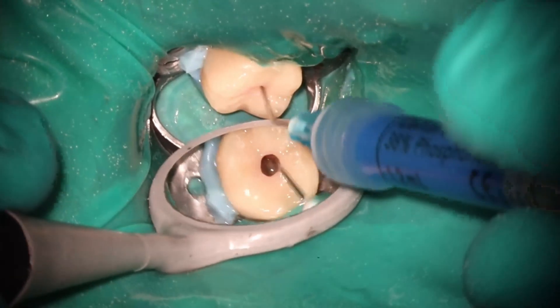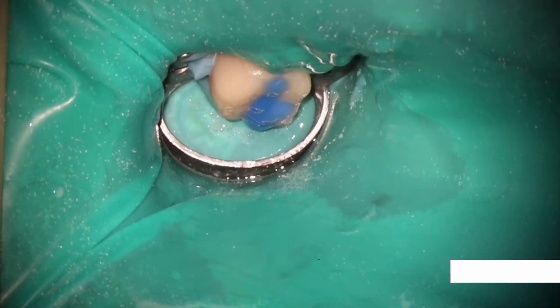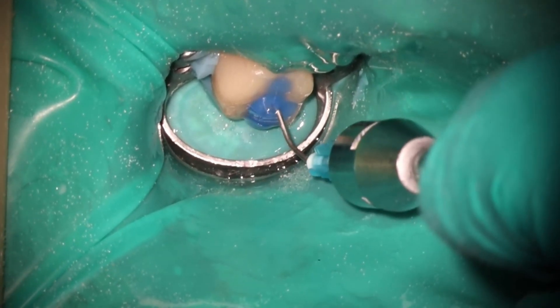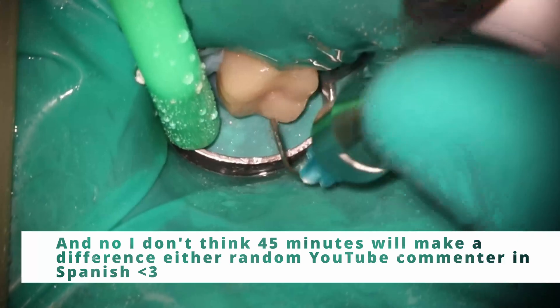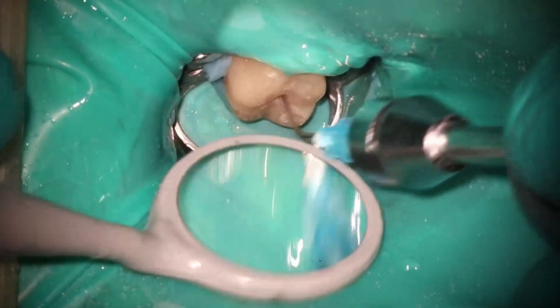I wasn't sure how the GentleWave was going to change the biofilm situation. It definitely removes more bacteria than the other options, but there is bacteria everywhere no matter what — SEMs show there's still bacteria inside this tooth even after the eight minutes; there will always be bacteria there. The question is: can you knock it down enough that the body can handle it and they're not going to come back and cause a problem?